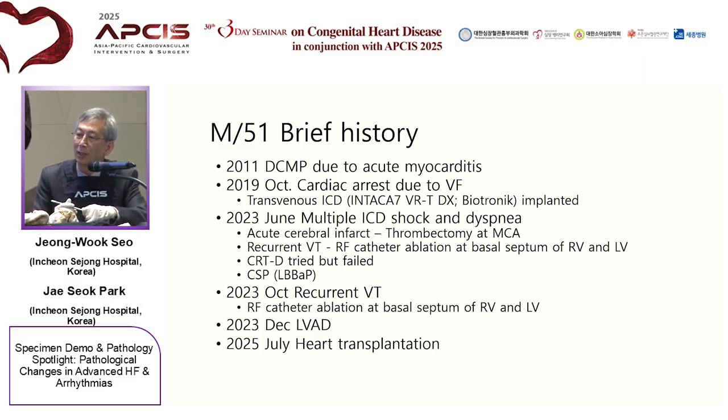He tried to have a CRT, but it failed. And then conduction system pacing, left bundle branch area pacing, was applied. But the result of the CSP was not very good, and the QRS duration was not very much improved. So multiple recurrent VT occurred again, and then LVAD and heart explantation this year.